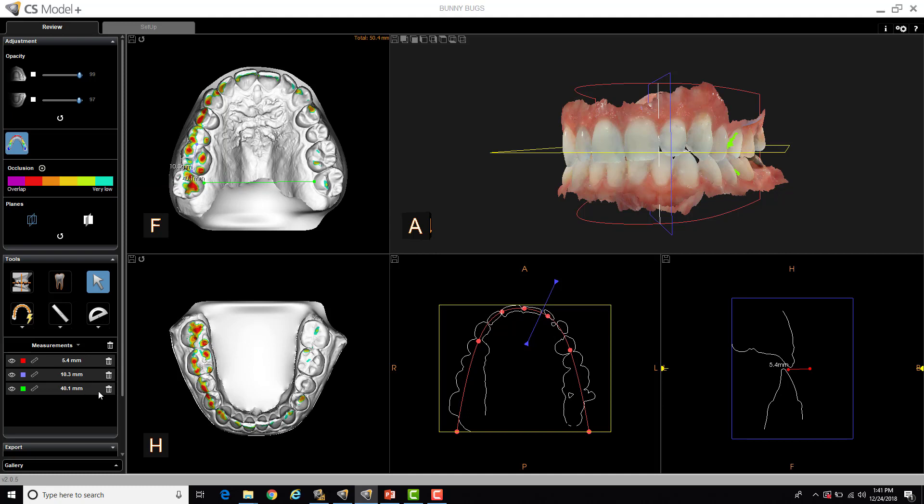Deleting individual measurements. I can hit individual garbage cans here or delete all of them. Or if I want to keep the measurements on the screen for future reference but just hide them, I can actually just select my show, hide measurements here.